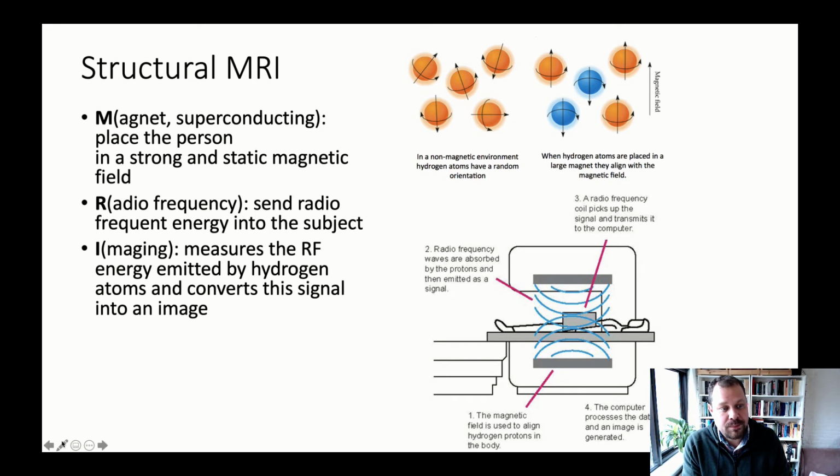You will find that atoms that are susceptible to magnetic fields, such as hydrogen atoms, which in daily life basically spin around in random directions, right? Atoms have a spin, and these directions are relatively random in daily life, with no net direction across all of your different hydrogen atoms. And obviously, hydrogen atoms are parts of water molecules, of which the body has about 70%.